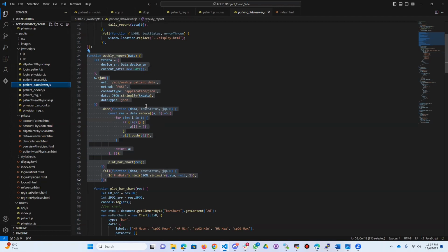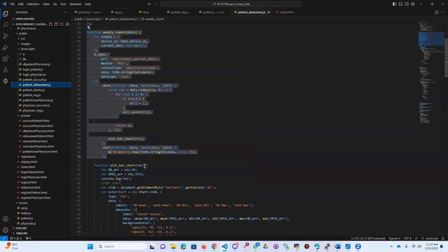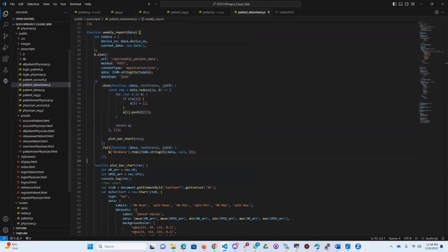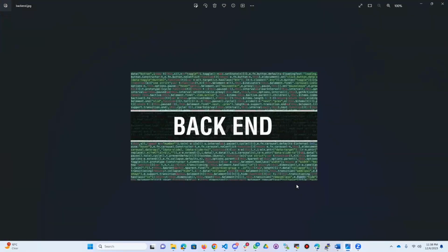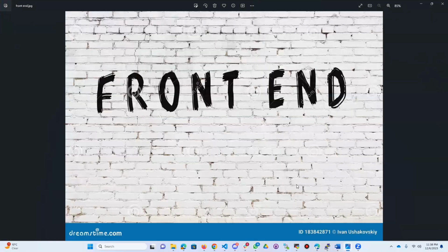And the function utilizes the Chart.js library to generate these, and visually we can see the charts. I have already shown you the chart. And now it's time for the back end. We were in the back end at the time. Now we'll go to the front end.